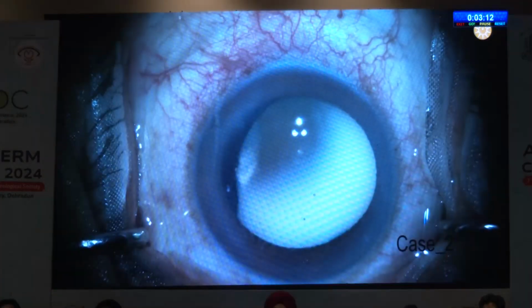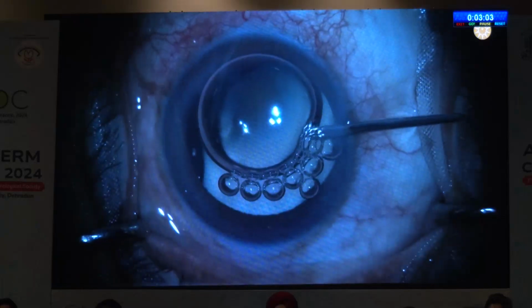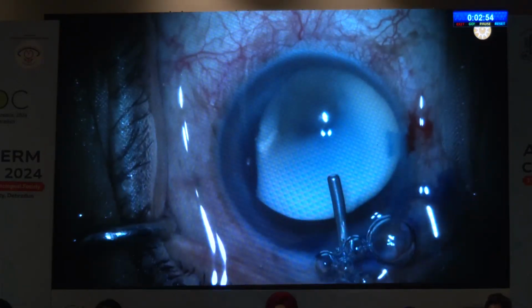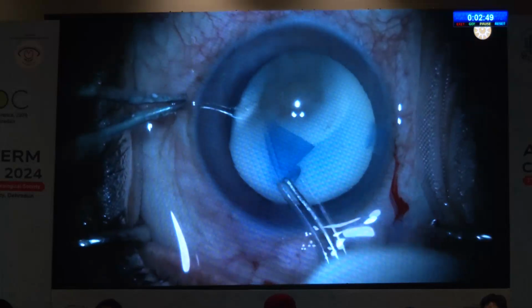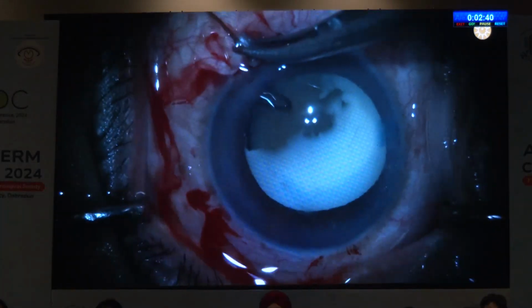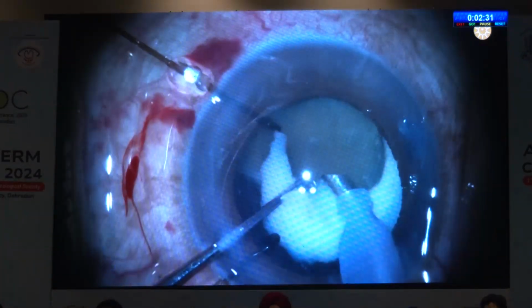This was a 75-year-old female who had a hypermature cataract with zonular dialysis of more than 4 clock hours. A temporal clear corneal phaco with foldable intraocular lens implantation was planned for this patient. The anterior lens capsule was stained with minimal use of trypan blue to improve the visibility of the rhexis margin. A 5.5 mm rhexis was fashioned, which is the desirable size for a hard cataract. Hydrodissection was not required in this case. The capsular bag was stabilized by two capsular hooks placed in the area of the zonular dialysis, and phacoemulsification was done.